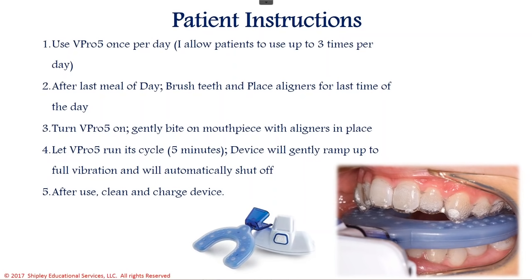So after the last meal of the day, we have the patient brush their teeth. They place their aligners for the last time of the day.